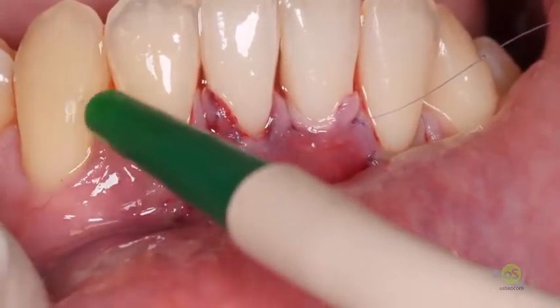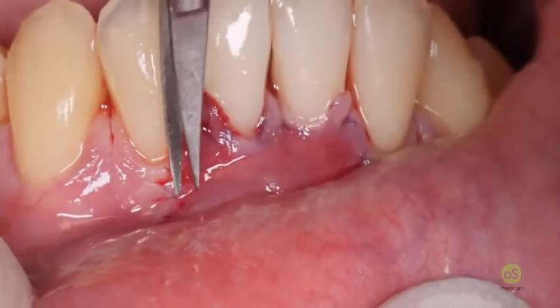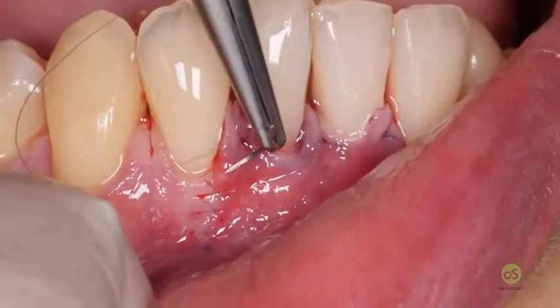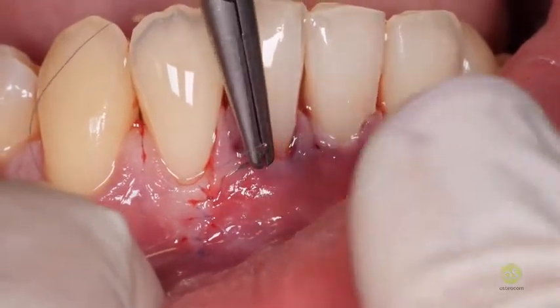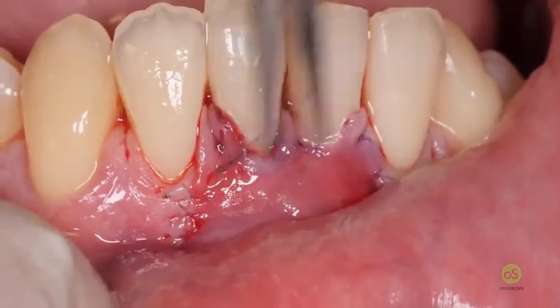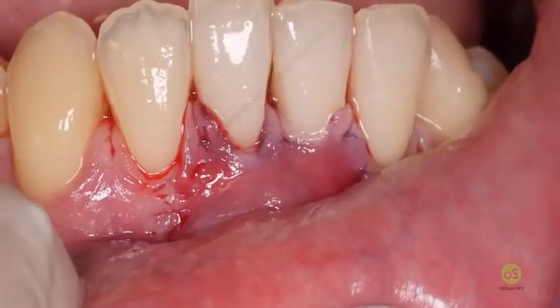And now the last one, that is the oblique in the opposite direction to connect the surgical papilla to the adjacent attached gingiva, and this is done from coronal to apical direction in this way to join this tissue without getting to the soft tissue margin, only with this and the closure of the vertical releasing incision.